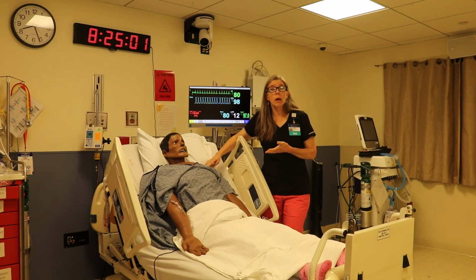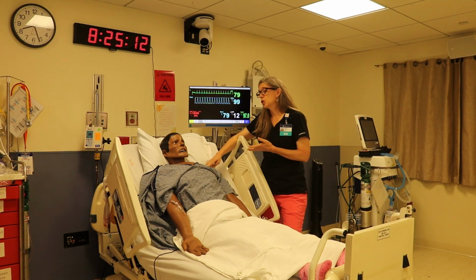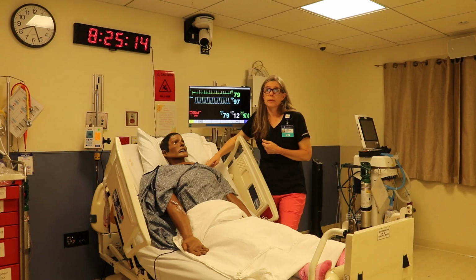The mannequin cannot move in response to your commands. Skin temperature and color cannot change, and swelling and edema cannot be reliably simulated. In addition, a facial droop cannot be simulated.